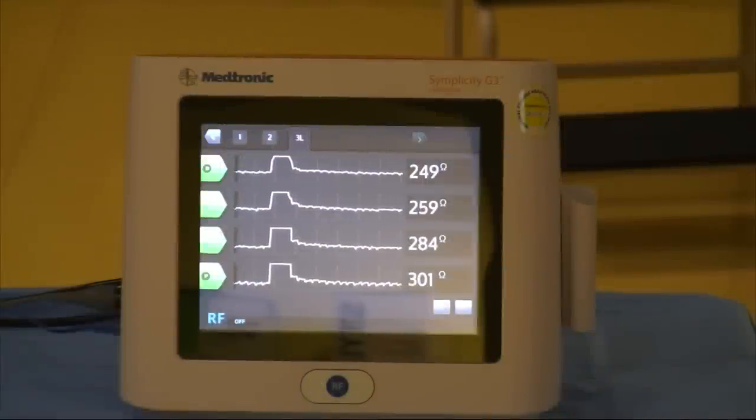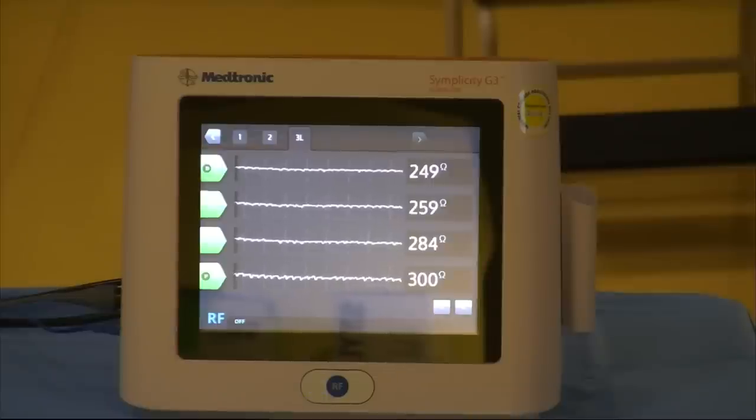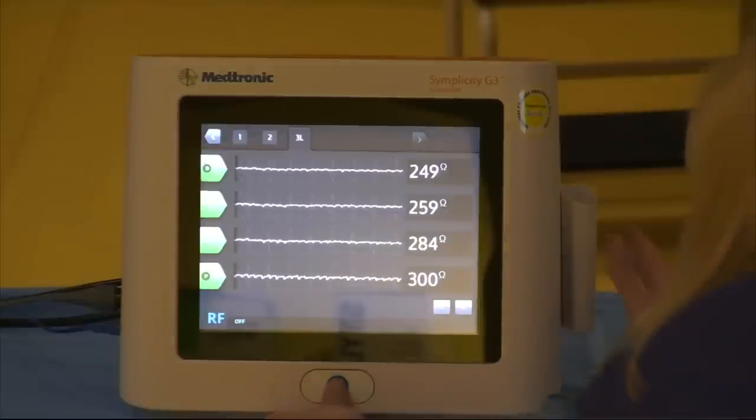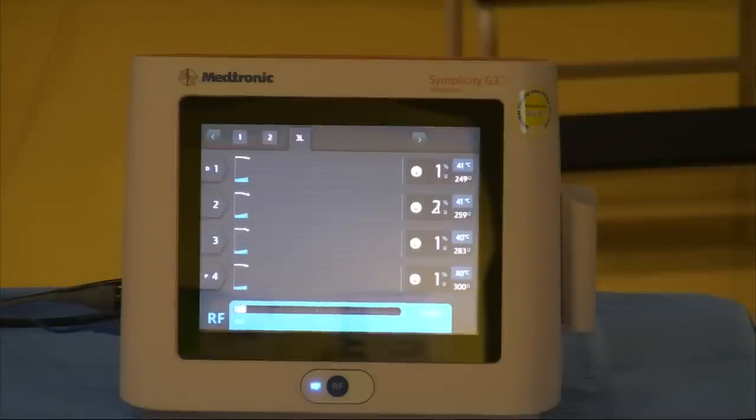Yeah, from 249 for the most distal to 301 for the most proximal. And they all look nice and stable. So, we'll kick off there and we'll start our ablation. I'm just going to hold the catheter as I always do, just in case the patient becomes agitated. This gentleman, as he said, everyone varies hugely. He's had the same regime and he's fast asleep and snoring and felt absolutely nothing from the first series of ablations.